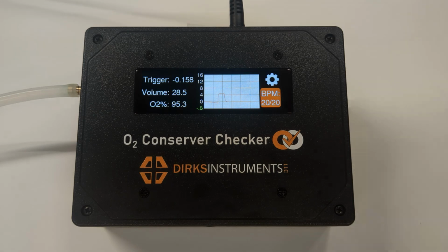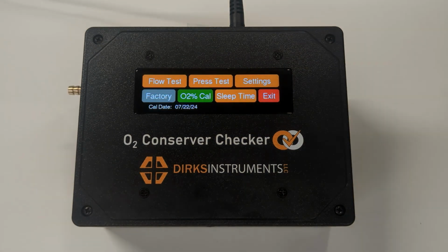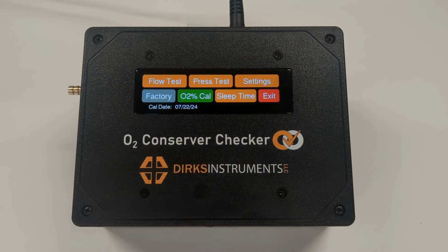When plot mode is turned on, our graph will size to show the total time of a breath at the current setting. So for 20 breaths per minute, our graph is 3 seconds. Each vertical bar in the graph represents half a second regardless of the breath rate. The factory option does not have anything that the end user will be able to use. This has basic settings that are set at the factory.